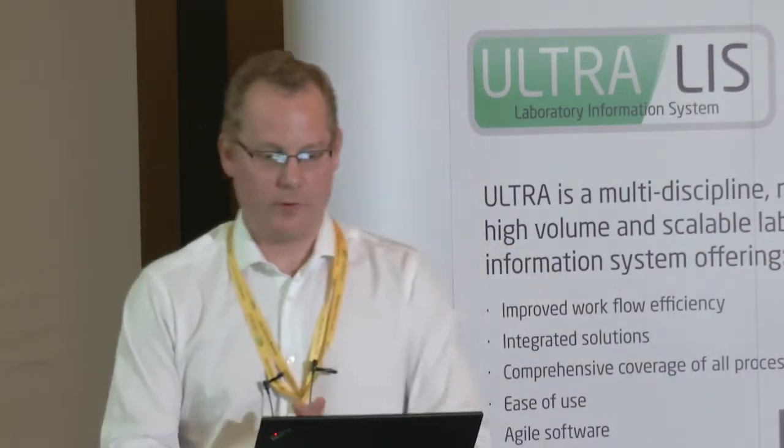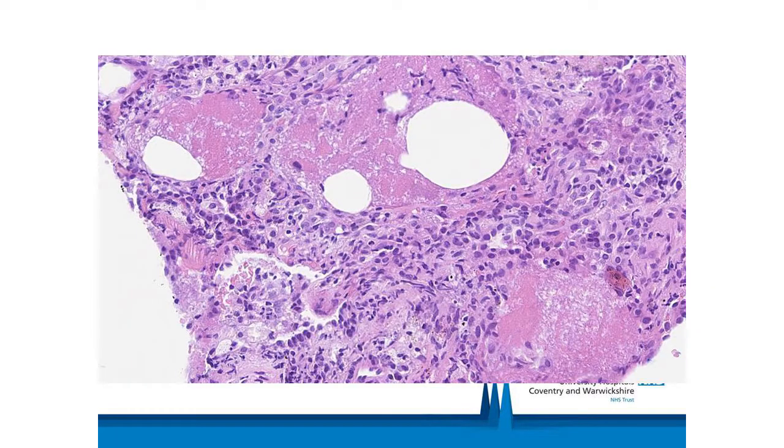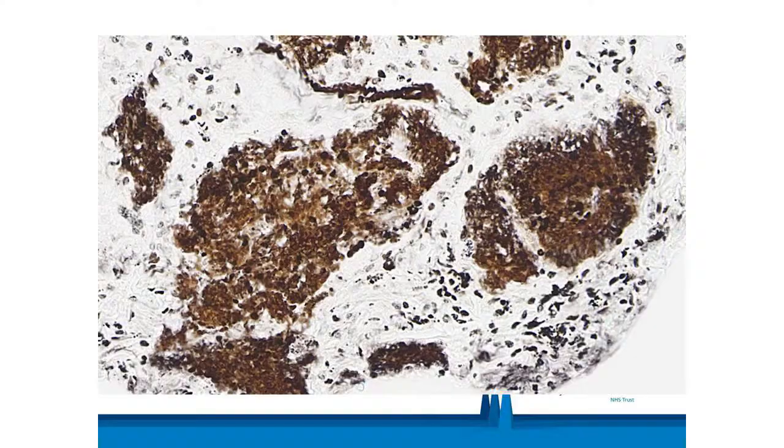And here's this transbronchial biopsy showing pneumocystis. The alveoli are filled with this pink, homogeneous, slightly granular, vacuolated, foamy exudate. And when you do the silver special stain, you can see the pneumocystis organisms packing out those alveolar spaces. So you can see all the detail that you need to do on the digital system.